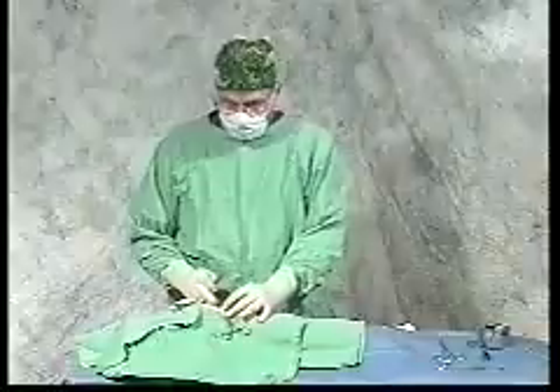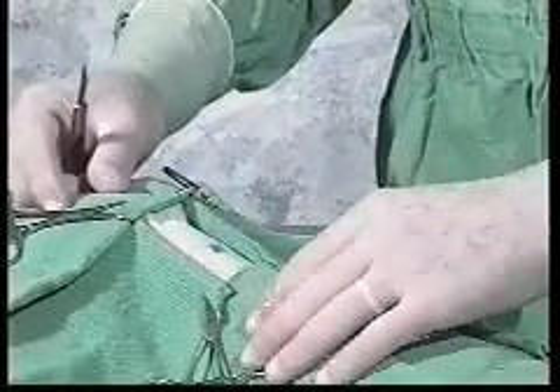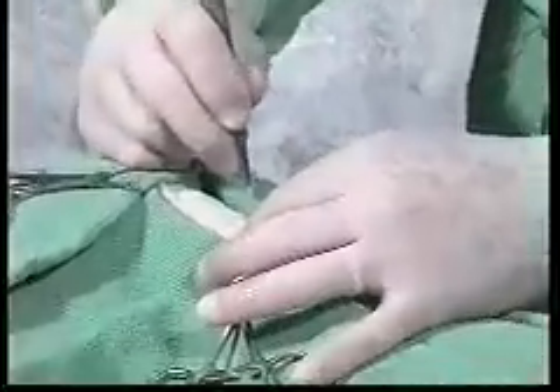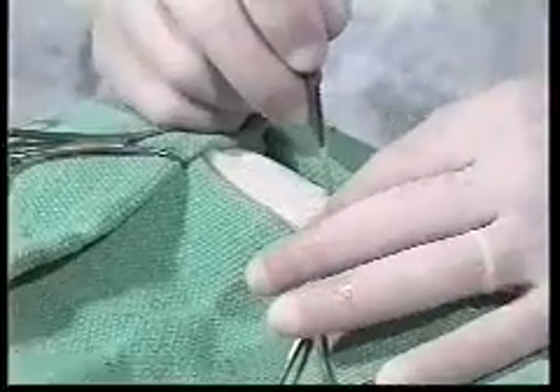Next we are going to make a small incision right in the location of the X. By the way, this is the base of the skull right here, and these are the shoulders. We are going to make a small incision with a number 11 blade. Make sure it goes deep into the subcutaneous tissues.